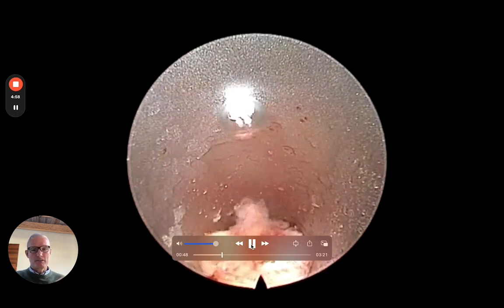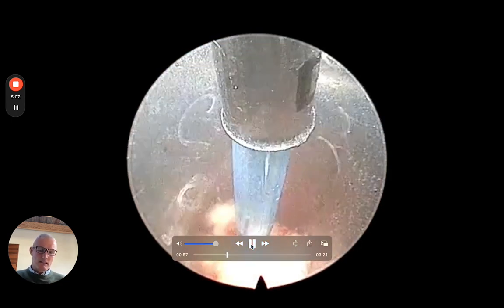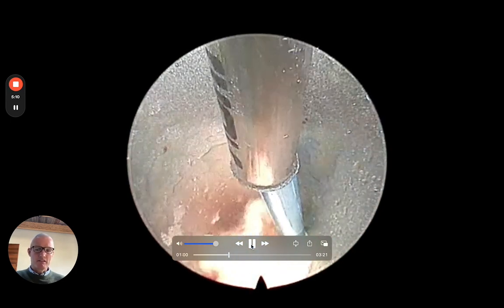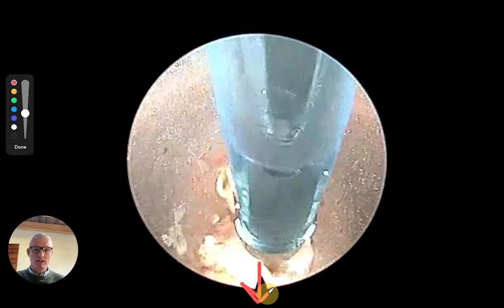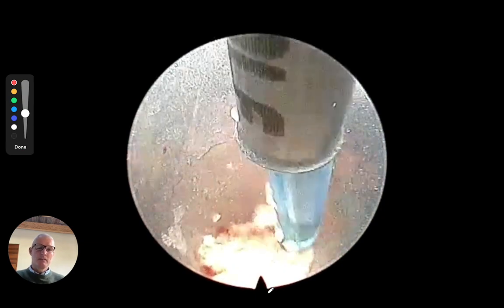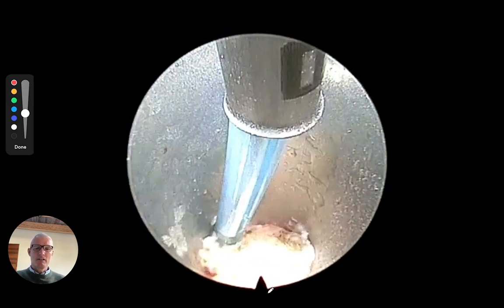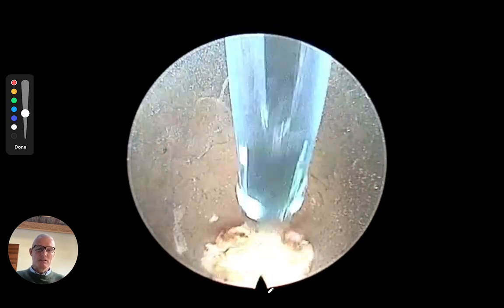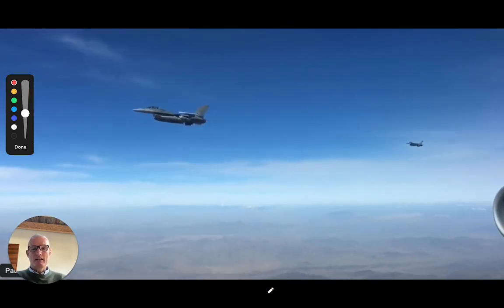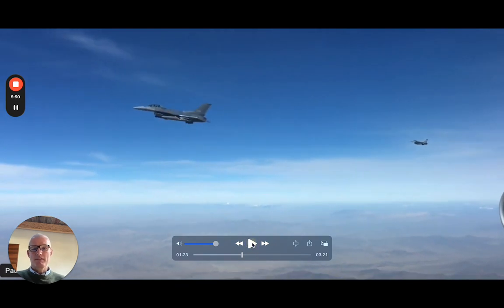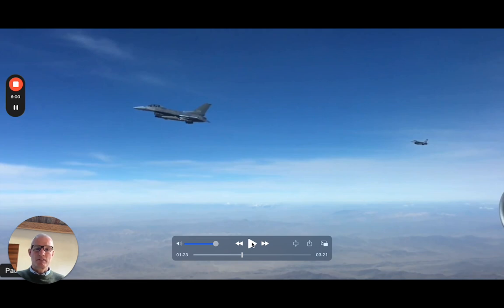Once we've got this view established, we'll use the bipolar cautery device to shrink around the periphery of the annulus to clean up the epidural fat and the veins that are usually sitting on top of the annulus, recognizing that the pathology in this situation is probably located just underneath and behind us. Once we've got initial hemostasis achieved, we're going to use a technique I describe as a split-S — an aerobatic flying maneuver — where we're going to roll the entire camera and scope inverted, like two F-16 fighter jets executing a split-S after an aerial refuel, rolling completely inverted and then looking through the canopy to execute the dive.